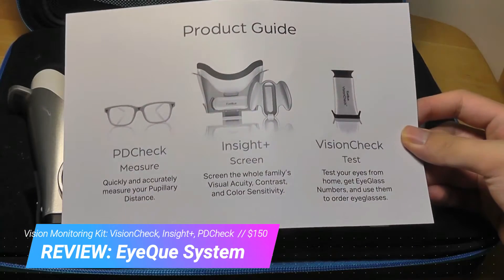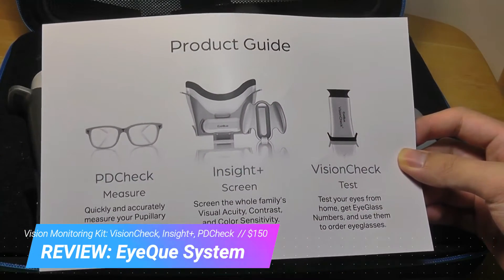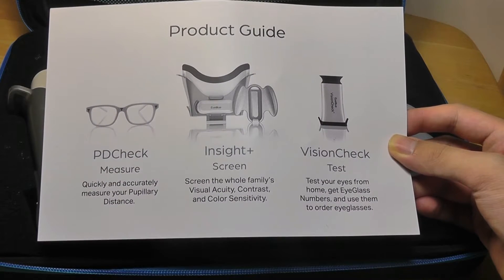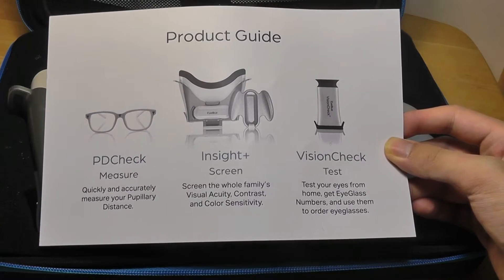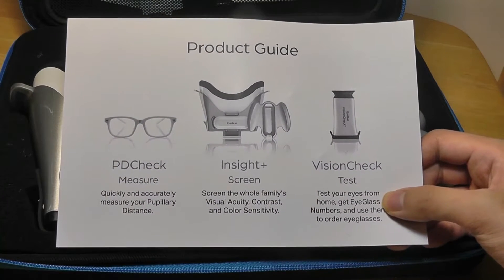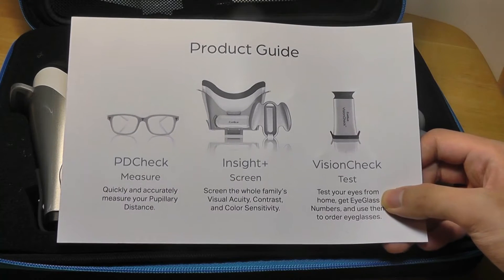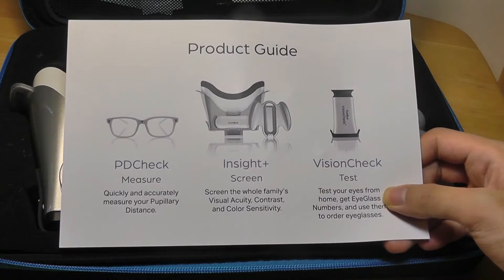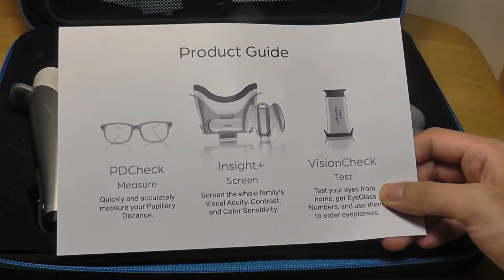It's actually a kit because it includes three products inside: the PDCheck, the Insight Plus — which tests your color sensitivity and visual acuity — and finally a vision check for your eyesight, whether or not you need new glasses, what your prescription degrees should be. It gives you a number you can use to get lenses and order them without needing to visit your eye doctor.